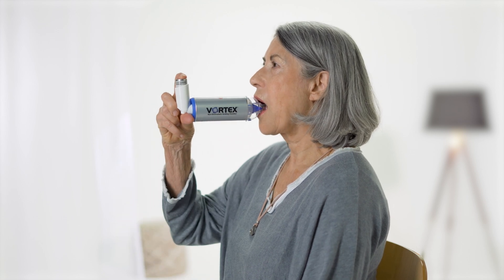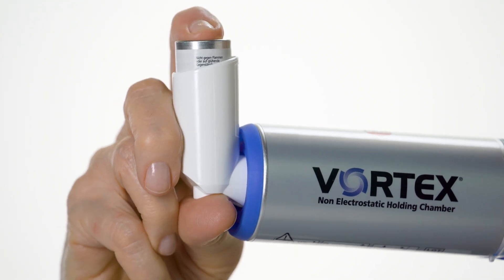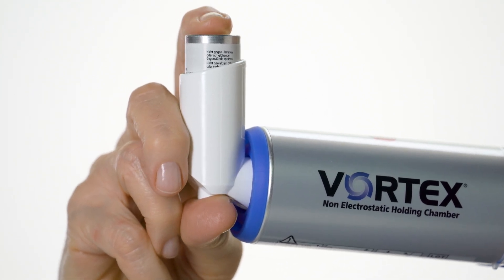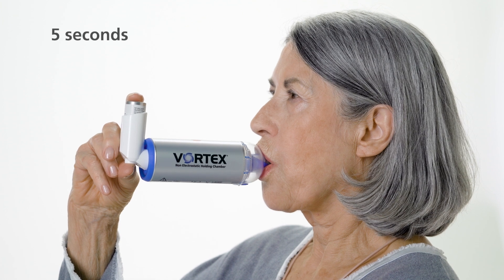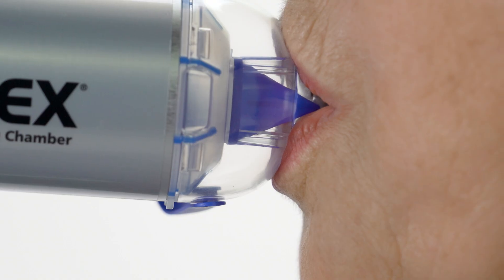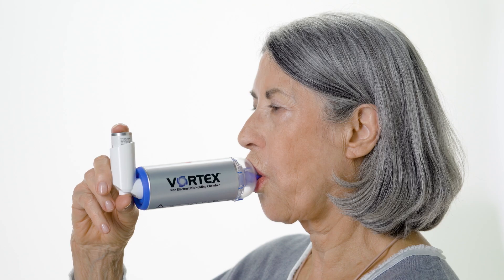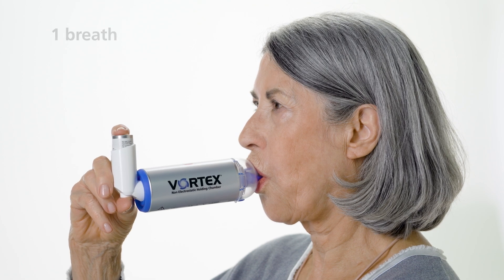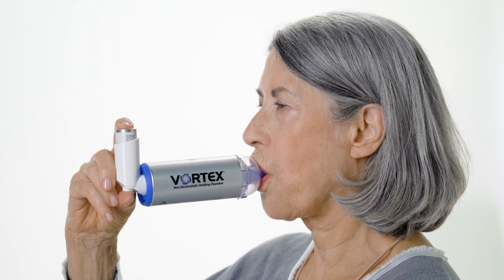Sit up straight in a relaxed position. Hold the mouthpiece between your teeth and enclose it with your lips. While breathing in, press down on the metered dose inhaler to release a puff of spray. Hold your breath for about five seconds, or as long as is comfortable. Then breathe out slowly into the mouthpiece. Unless your doctor has advised you otherwise, one breath is enough to inhale the medication from the Vortex.